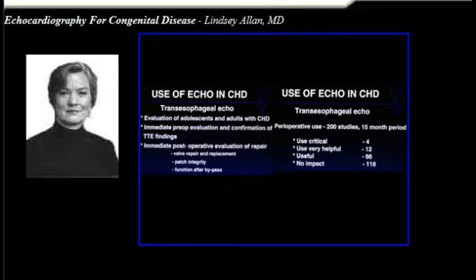That means mostly we're getting the transthoracic imaging correct. We've got the information before we go to surgery. And there are only a small number of cases where its use has been very useful. But that also reflects on your surgeon. In general, if the surgeon is good, then we won't have to go back and make changes to the surgery if we find something as we come off bypass.